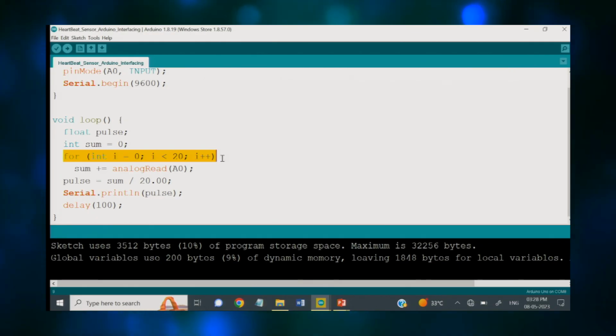Why do we need to add this additional sequence without directly getting the data from the A0 terminal? Because as per the manufacturer specifications for this particular sensor, it gets affected by noise in the surroundings. So, if you have not held your sensor accurately within your fingers, maybe it is held very tightly or loosely, in that case you can experience some noise within the terminal.